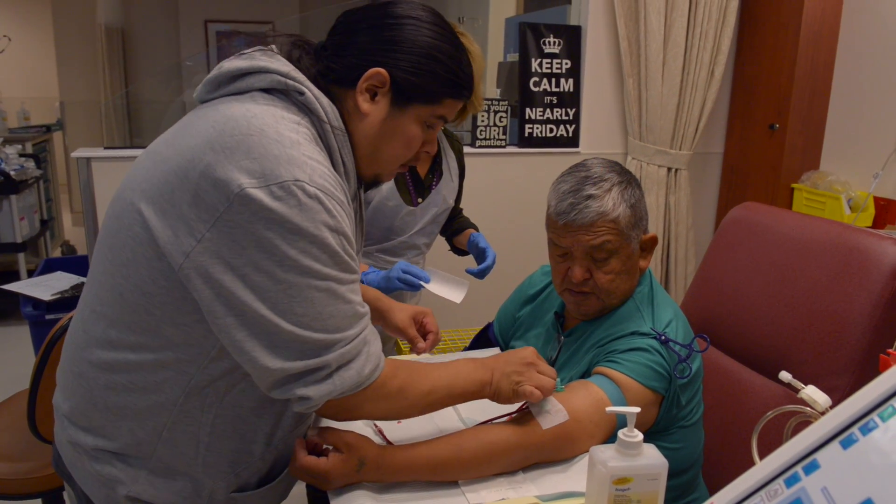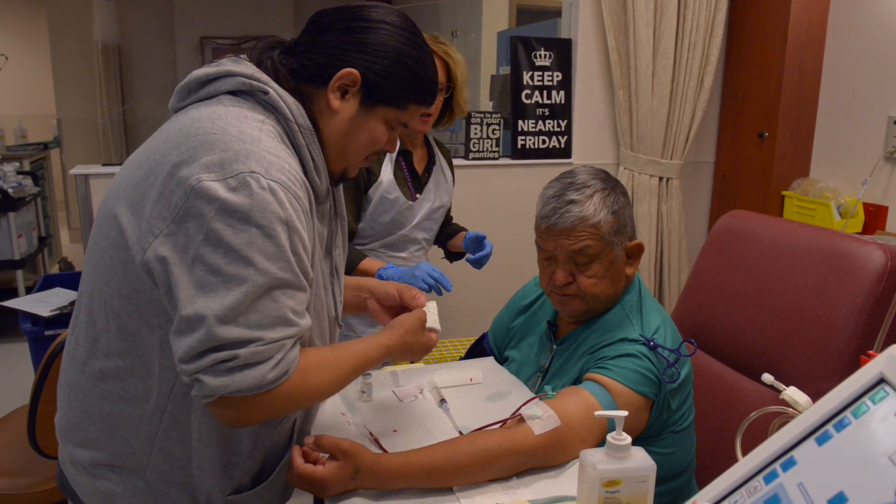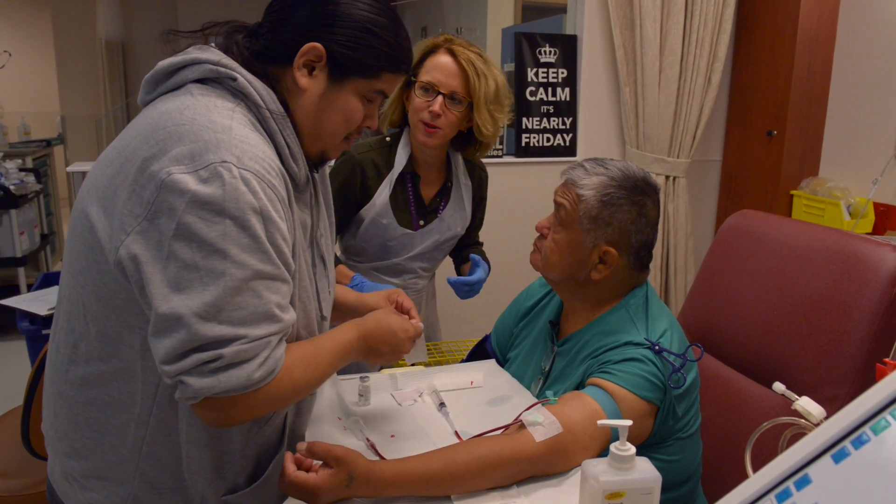Wow, it's nothing like the nurse not watching. You're just fine. Do you remember the first time you put the needles in?